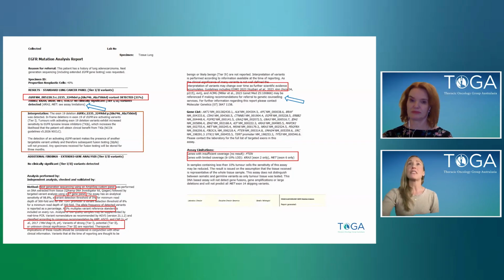So this is a type of transcript, and I think the simplest way to think about this is that there's quite a few different editions of how you can look at the same gene. And there's been a kind of consensus between the different groups that brought out all of these different editions or transcripts, and there's now more homogeneity across laboratories. They use this main transcript for oncology reports. It should be pretty consistent, but it's very important to put in there because your C dot and your P dot, which come next, could change depending on which edition you're using of looking at that gene. So that's what that NM is for.